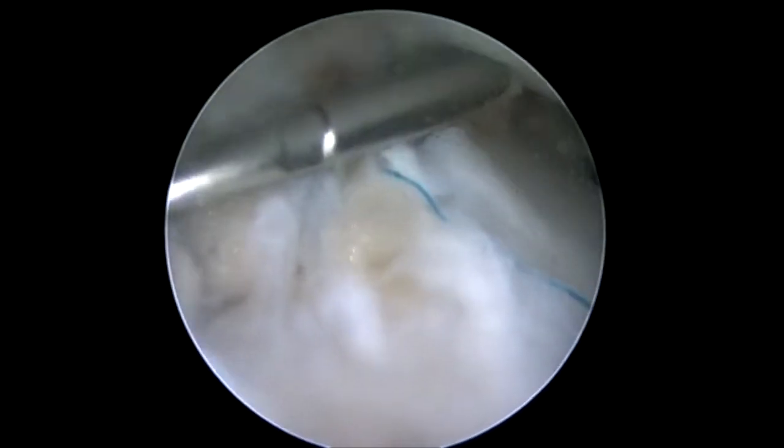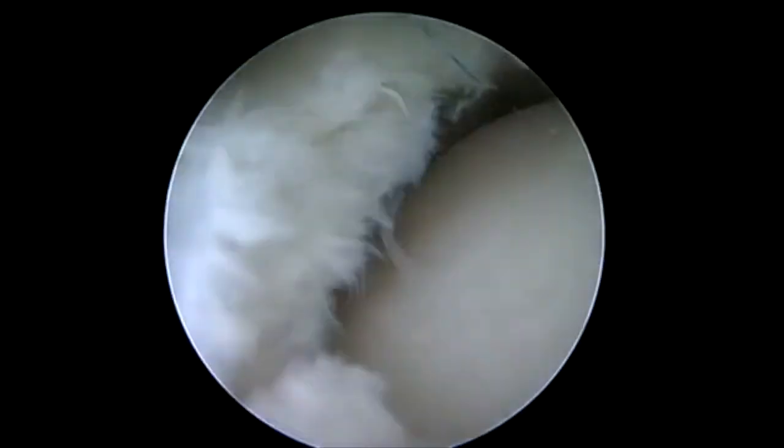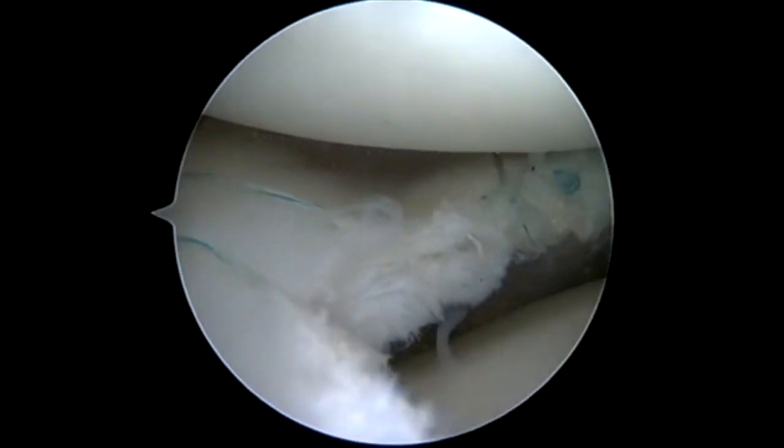So here we're bringing our NovoStitch Plus, extending our lower jaw in through the rent. By working it side to side, we're able to get it in through our rent that we've made and then just pass the needle. Now we'll retrieve our suture back outside and tie this, and we're going to pass one more anterior — simply pushed through and retrieved over the top — to make a nice easy repair of a difficult anterior horn.